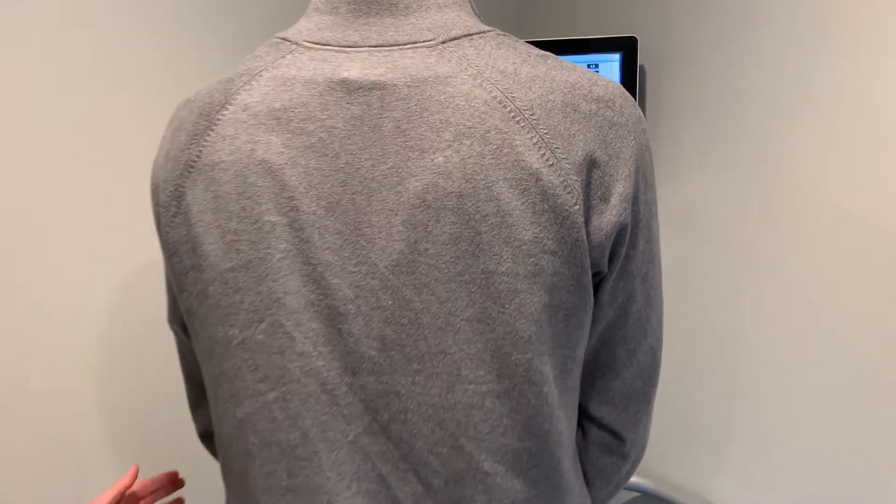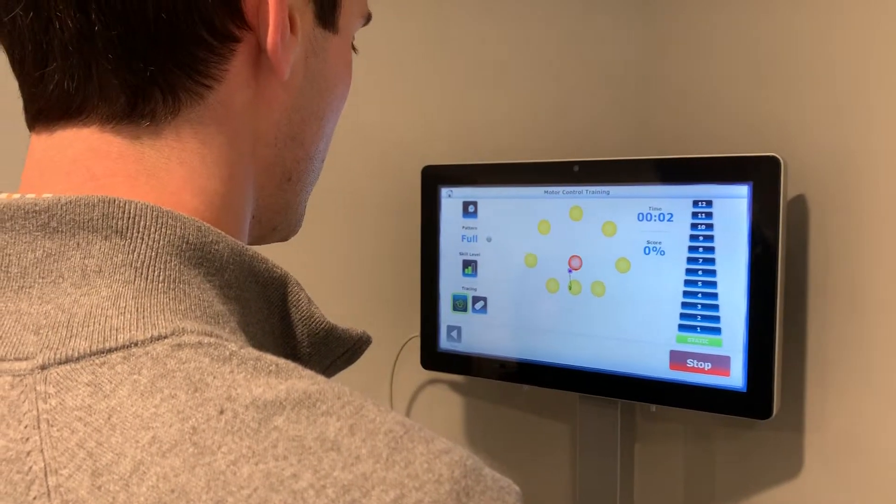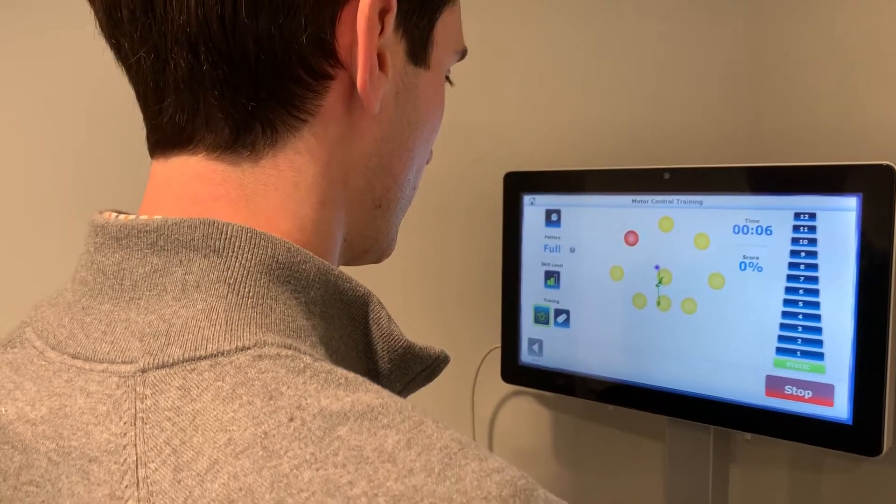What do you need to do with your body to accomplish the goal? We use this machine to give instant feedback, telling where the person is in space. So if you'll go ahead and push the Start button, the objective is to take the purple dot to the red flashing ball.